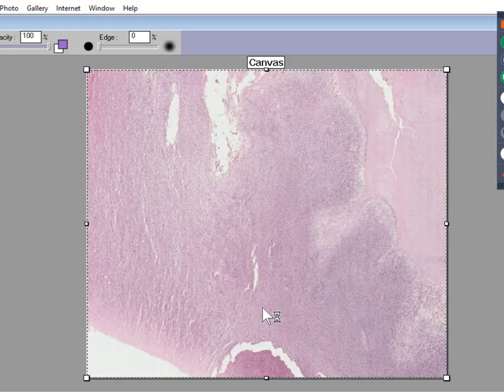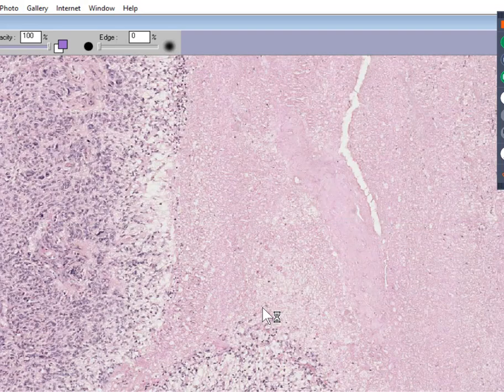And you're going, whoa, what the hell is this? You say, this can't look like anything. It just looks like smeared junk. Well, I got news for you, folks. It mostly is smeared junk. Why? Because whatever this tumor is, it's growing very, very fast, and it's outgrowing its blood supply. So most of the tissue here, especially this lighter tissue on the right, is nothing but necrotic tissue. It's not recognizable. It has no cellular recognition. Look, it's necrotic material, and it looks like it is almost liquefied.